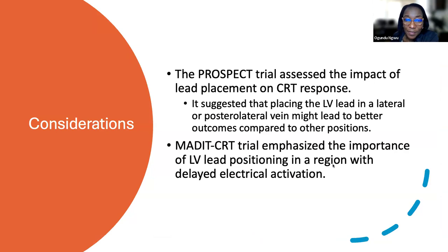Next slide. So the PROSPECT trial assessed the impact of lead placement on CRT response. Placing your LV lead in a lateral or posterior lateral vein actually leads to better outcomes. Multiple studies have confirmed that this is where you have your latest electrical activation. Some practices actually do a little bit of LV mapping with 3D mapping, and if you do that, you will also see that it points you to the basal LV, lateral LV, because that's where you have your latest activation. Next slide.